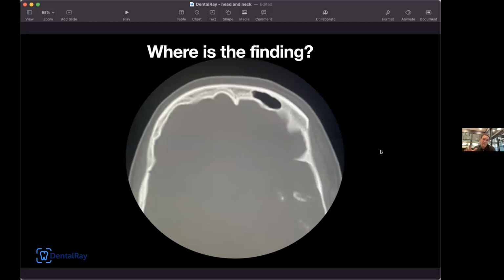When we expand the field of view and increase the quality of the imaging, we're going to see the intracranial structures. So you're looking at the level of the frontal sinuses. This is an air-filled frontal sinus of the forehead. Again, the nose is going to be up in this image if you're not as familiar with looking at CT images yet. And then all of this space in here is brain. Okay, so this is all fine looking.